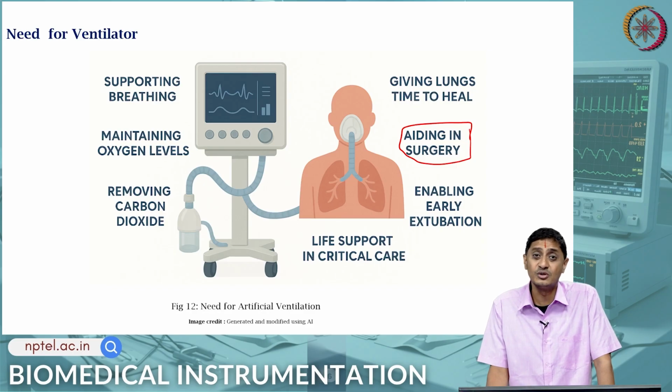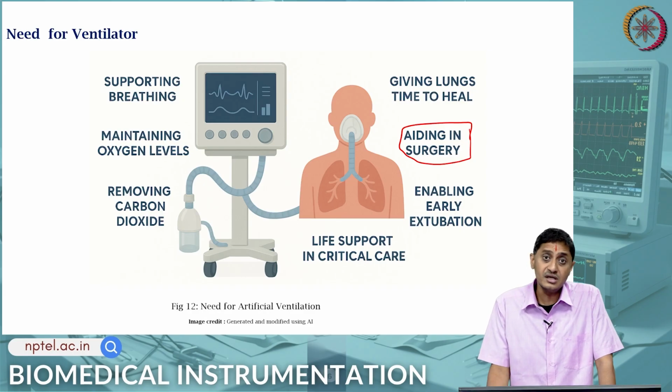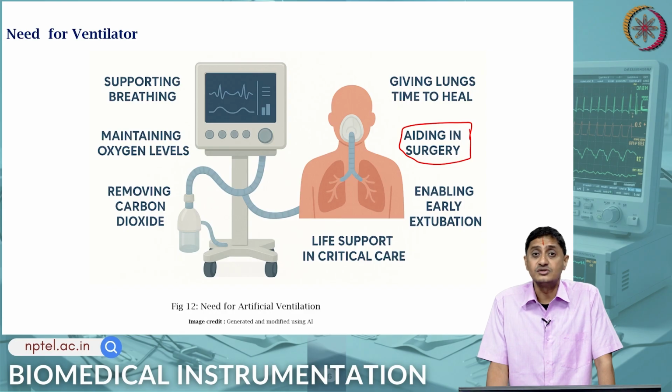What will happen if you do not remove carbon dioxide? There will be a buildup of carbonic acid, is it not? We discussed that in the previous class. That is a situation that causes respiratory acidosis. So, you have to not only add oxygen, you should also remove carbon dioxide, and it is absolutely critical in providing life support. So, it is a fundamental part of critical care units and intensive care units.